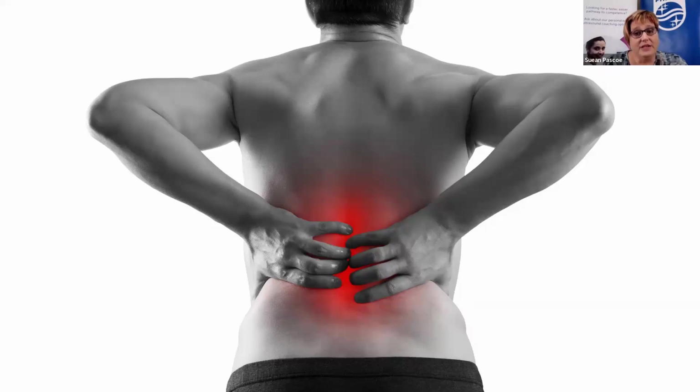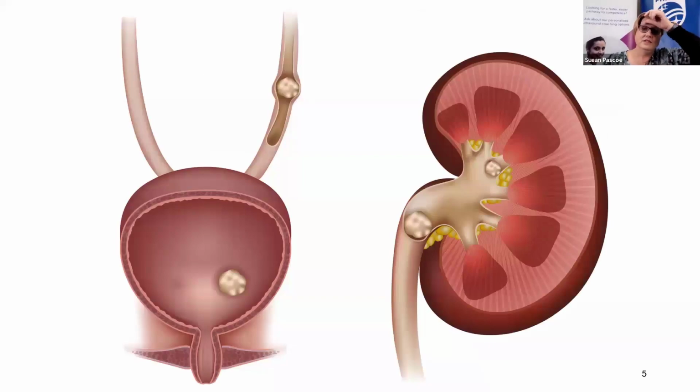Other factors that might come into play are the cost and the patient's tolerance for ionizing radiation. Have they had lots of tests? Are they pregnant at the moment? That might mean you make a different decision. So stone formation can be quite complex, and it can depend on the composition of the stone as to how visible they can be on ultrasound.